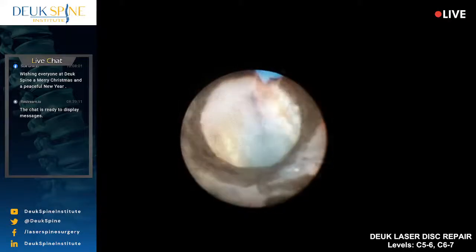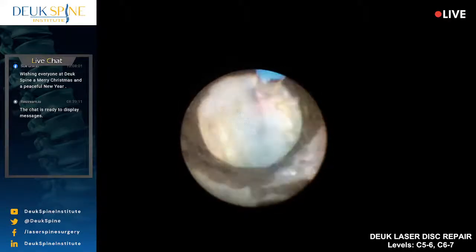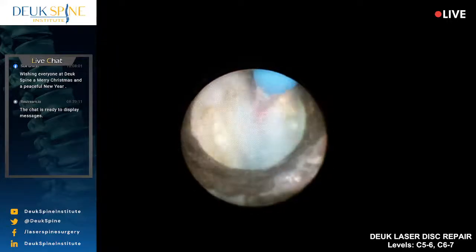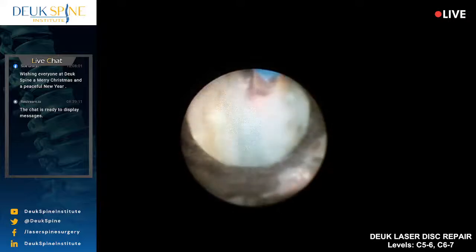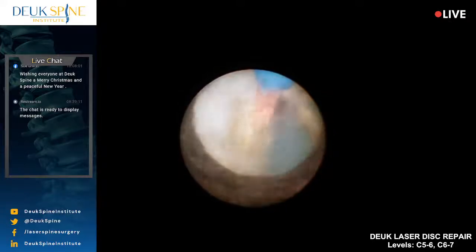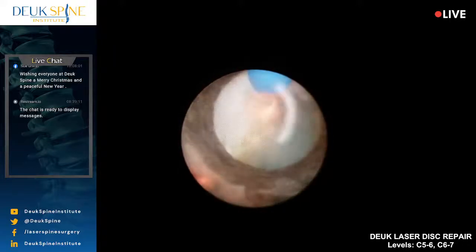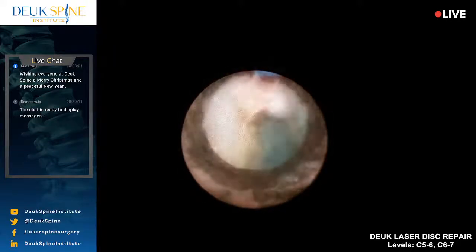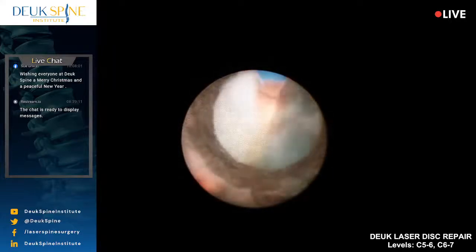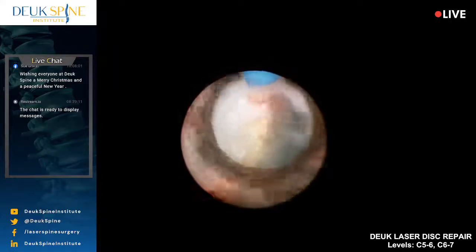All this stuff right here I'm zapping, that's all nucleus pulposus that has squeezed out through the tear. You can see the tear right there. And this nucleus has squeezed out through the tear, and it's literally stuck in the edges of the annulus, which is why the annulus cannot heal. That's the whole premise of the Deuk laser disc repair, is I'm going to let this annulus heal now because I'm cleaning the edges of the tear with the laser.